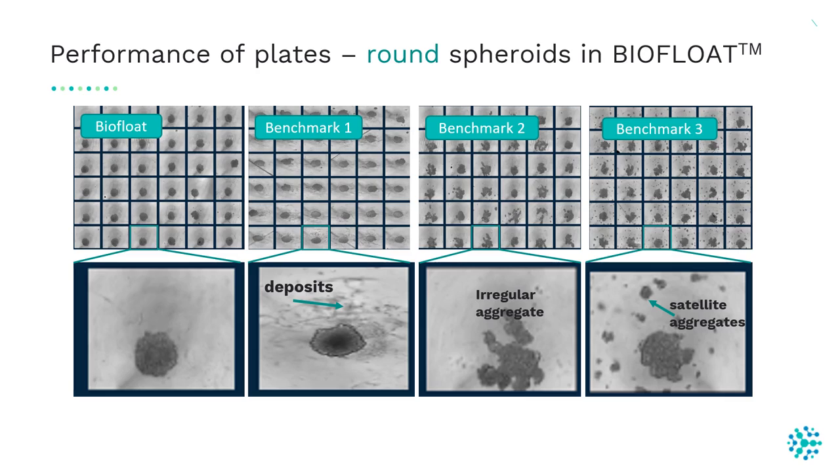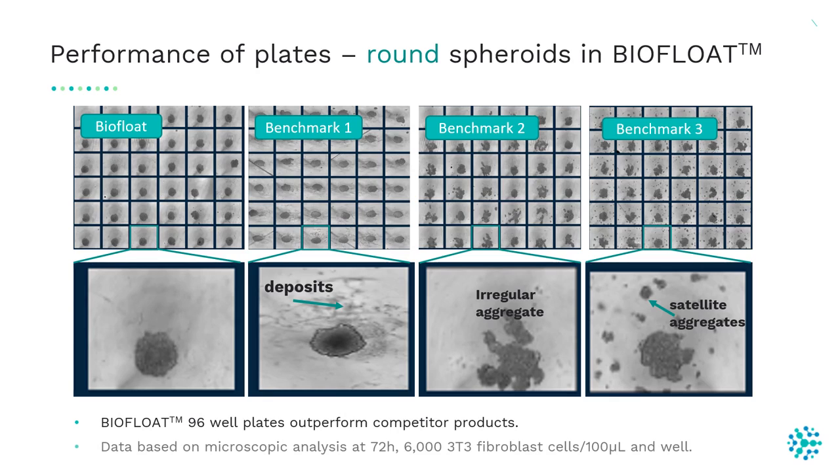In the BioFloat plate, spheroids have a perfectly round morphology. Spheroids also formed in three other benchmark products, but they showed small deposits, irregular shape, or satellite aggregates. So our BioFloat plates outperform competitor plates in spheroid formation.